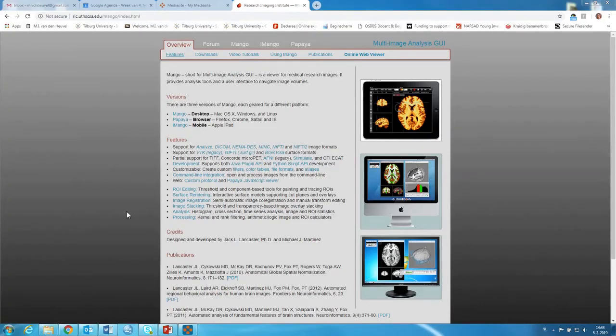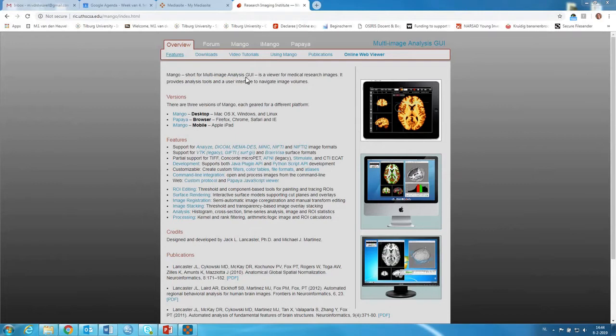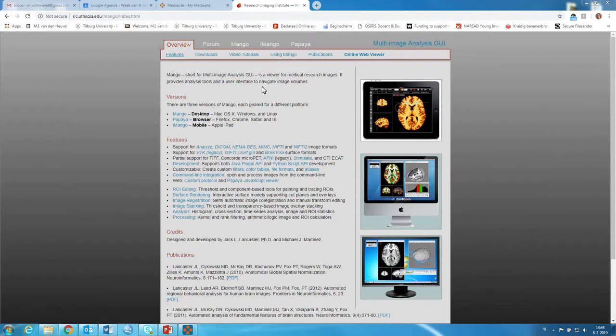Hi everyone! In this video I'll show you how to download and how to work with Mango. Mango is short for Multi-Image Analysis GUI and it's basically a viewer tool for medical research images. It provides analysis tools and a user interface to navigate image volumes.